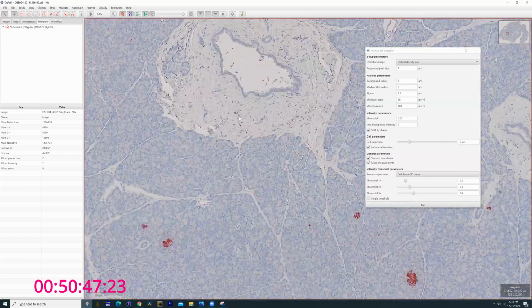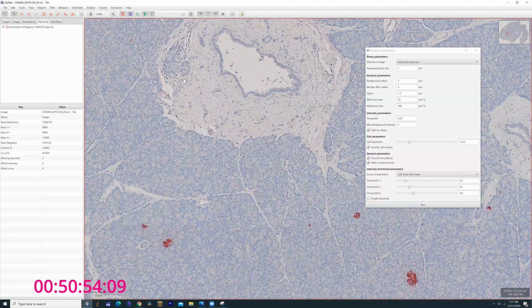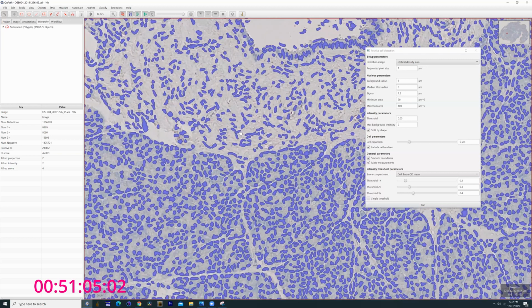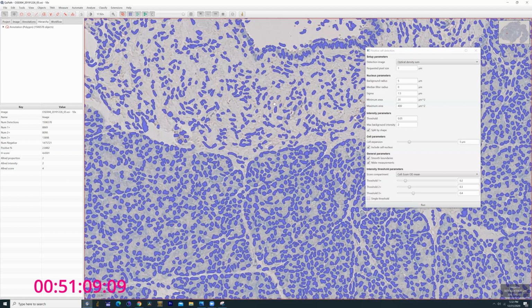And like I said, these are the areas where there's the most room for correction. Basically, this is probably about right. This is actually tissue, but this other stuff, it's really hard to tell if it's real or not, honestly. Some of this is obviously or probably not nuclei. Actually, you know what?